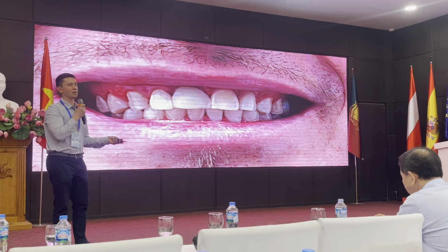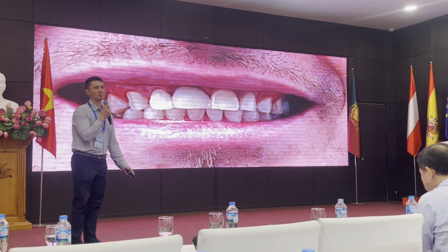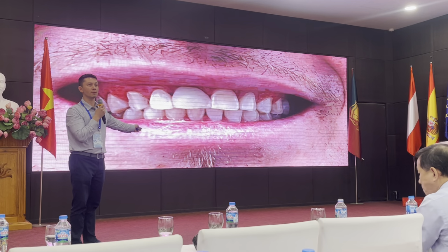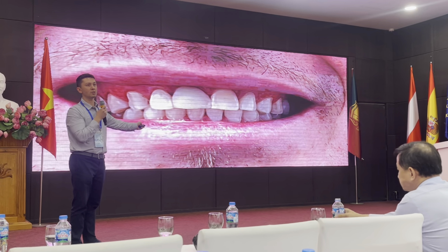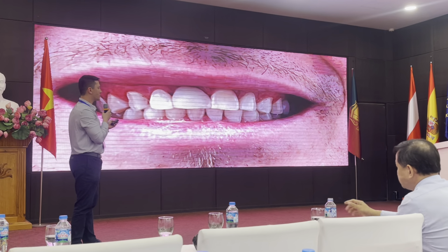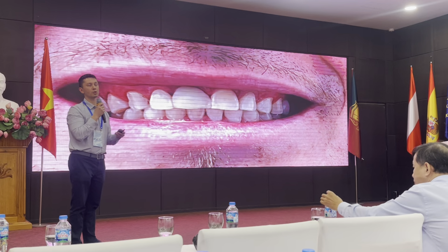But another topic that we've already been talking about today is primary stability. With the TSX implant, we had 70 newtons of torque. 70 Newton centimeters of torque means a very, very strong implant has a low risk of failure due to occlusal overload.